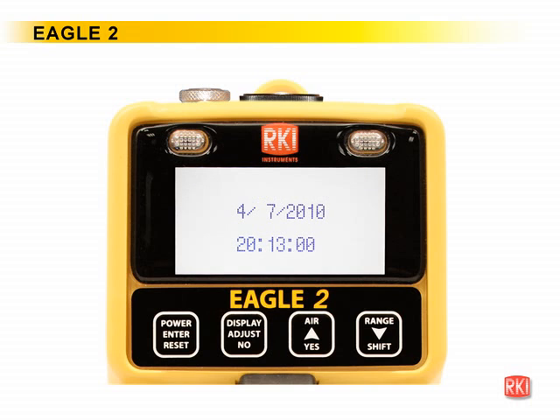The Date Time screen appears for a few seconds. If User Station ID is turned on, the ID screen appears for a few seconds. If User Station ID is turned off, only the serial number is shown.